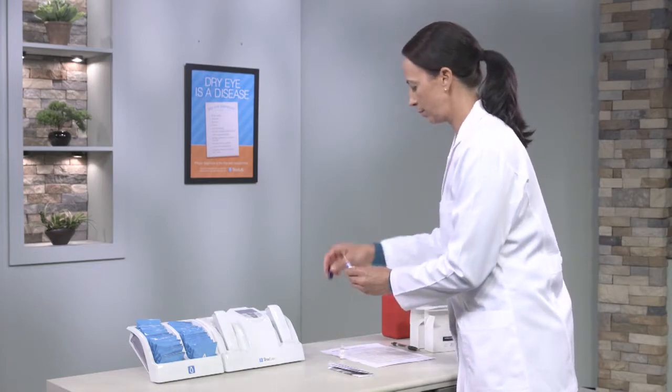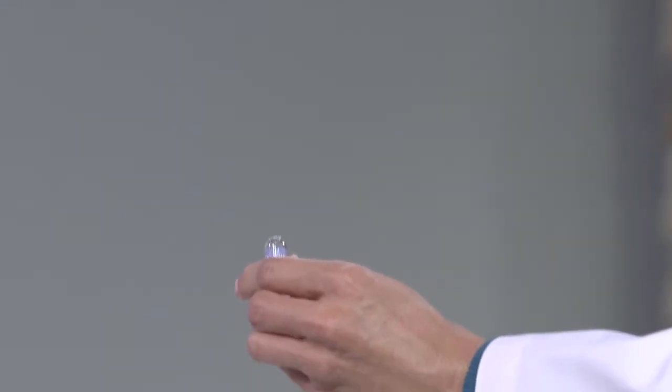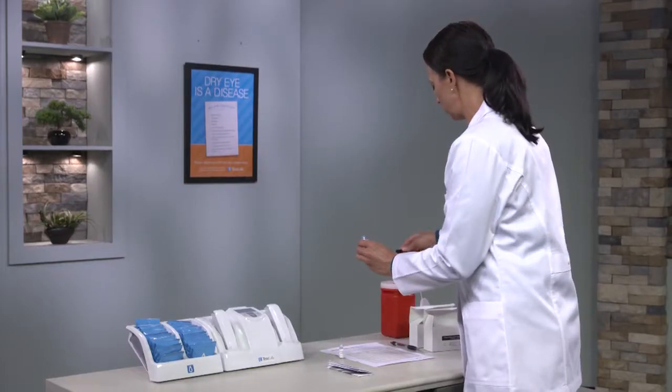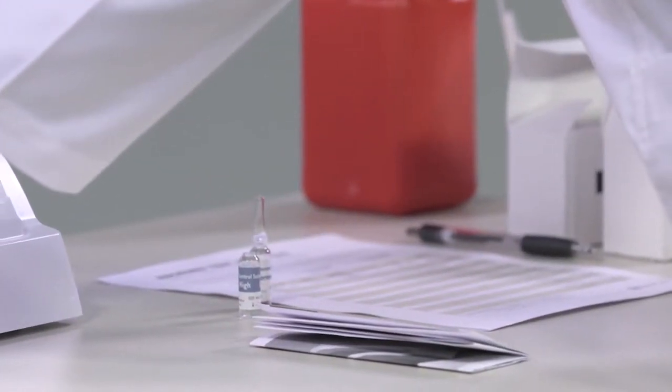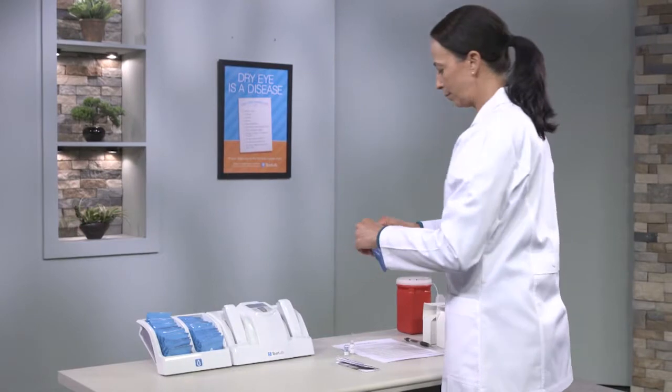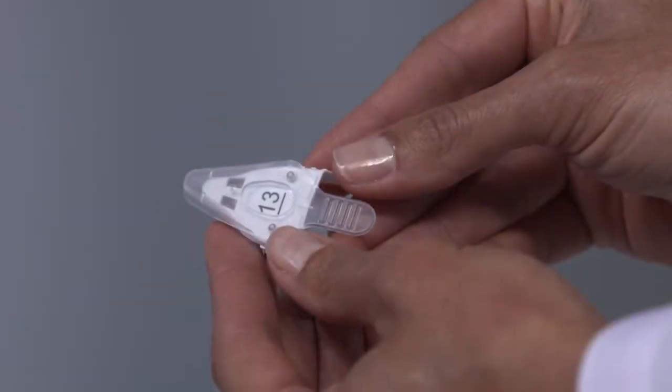Insert the sleeve onto the ampoule and snap the top off. Dispose of the broken glass appropriately and place the ampoule on a flat surface. Remove a test card from the pouch and note the code on top of the test card.